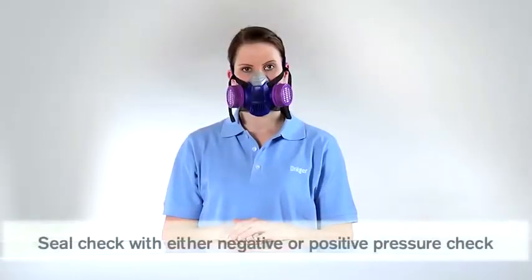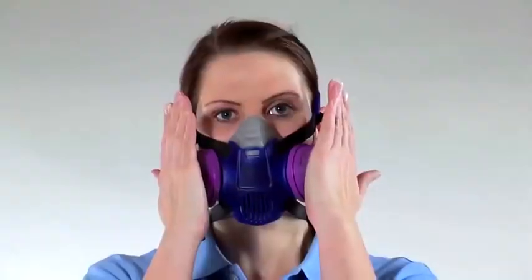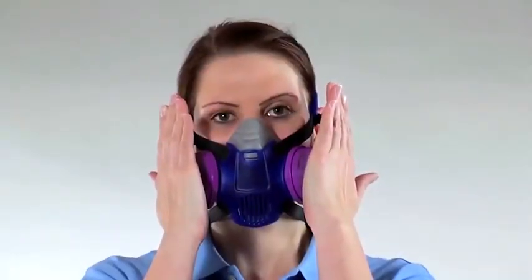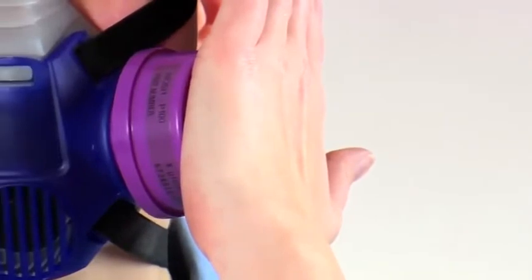You can perform either a negative or a positive pressure check to test the seal of the mask. For a negative pressure check, seal both filters with your hand and breathe in until a negative pressure is generated. Hold your breath for a few seconds and negative pressure should be maintained.